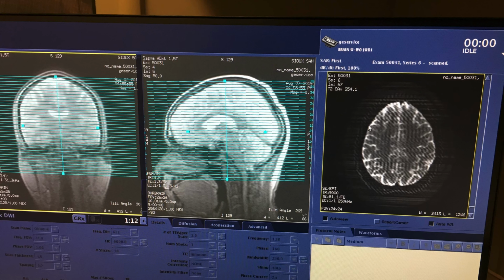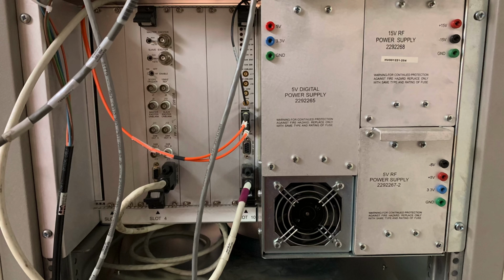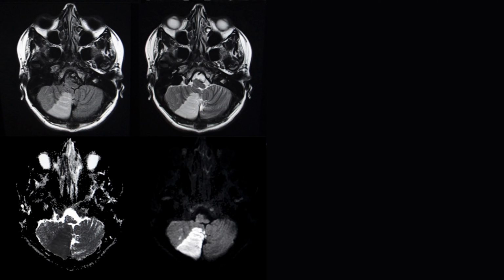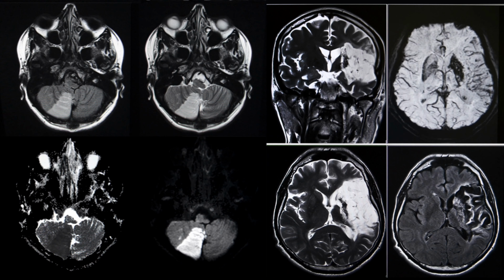DWI scan protocols are T2 weighted imaging sequences that utilize partial k-space-based reconstruction algorithms to provide ultra-fast imaging reconstruction. This MRI scan sequence allows for diagnostic quality images to be produced in seconds as opposed to minutes, and that makes this scan sequence a preferred imaging method when patients are suspected to have suffered a stroke or trauma.